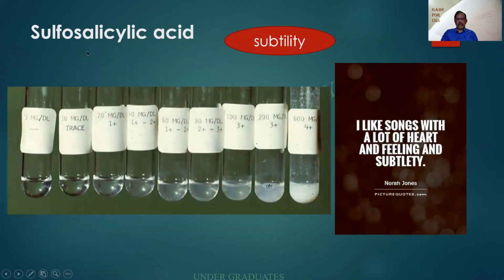Look at this one over here, sulfosalicylic acid. I hope you people are able to identify where the precipitate starts and where it ends. Ending is obvious, but where it starts, you people can make out by yourself. Look at this one, trace, 1 plus and so on till 4 plus. The grading, I would like you people to answer. Definitely, I will ask you in the exam.